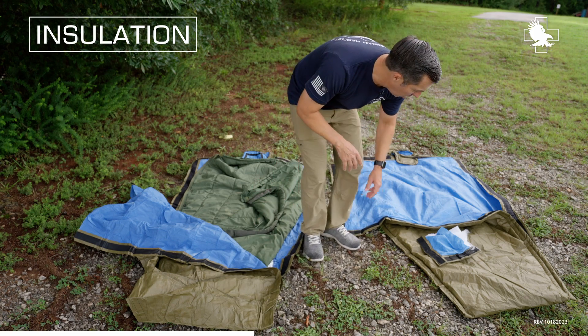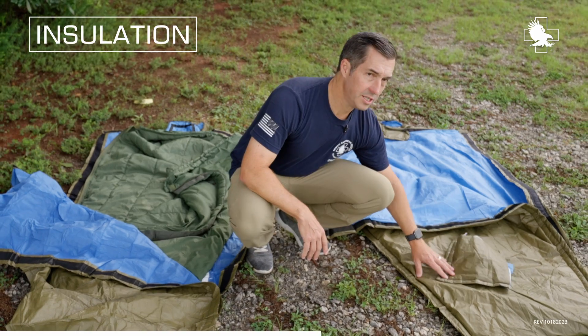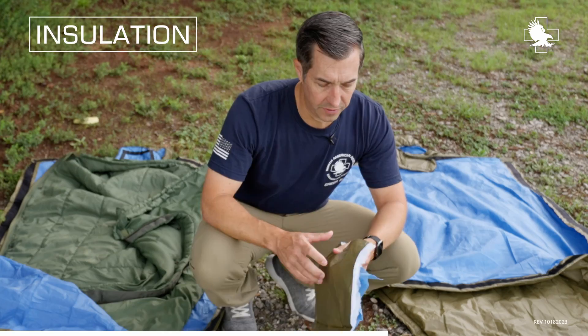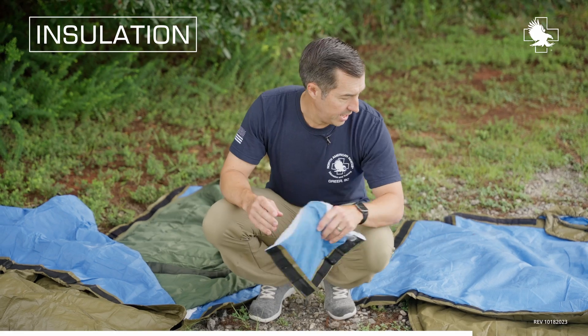If you don't want to use that and you want to have it all in one package, you can use the HPMKi. Here is the HPMKi with the added layer of climate shield. We've got the outer protective barrier, we've got the climate shield built in, and then we've got our blue layer.